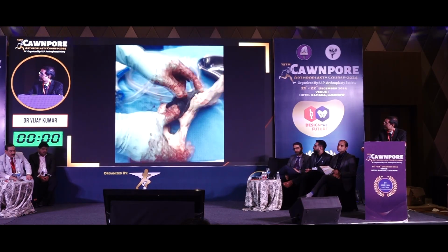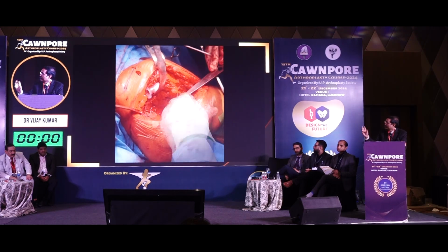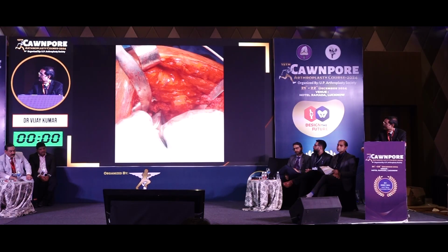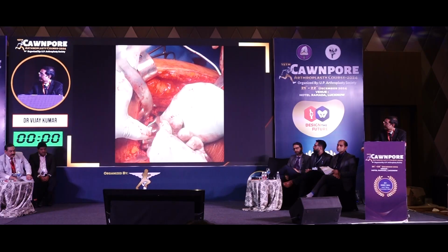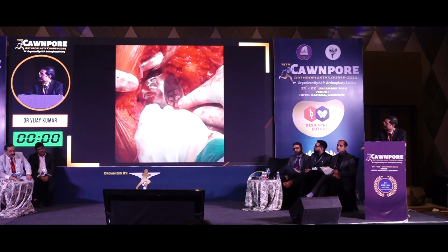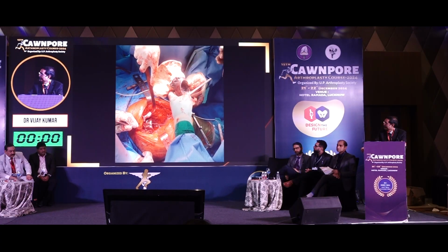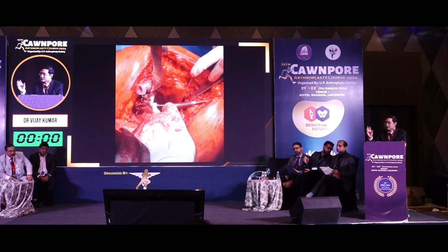So they also give you a pelvis along with the template. Here you can see how it is, and then the most important thing is the juggling to put in the 3D printed cup. So sometimes it takes a lot of time to figure it out. Then, you need this intraoperatively as an assistance. And once it is there, it is rock solid.